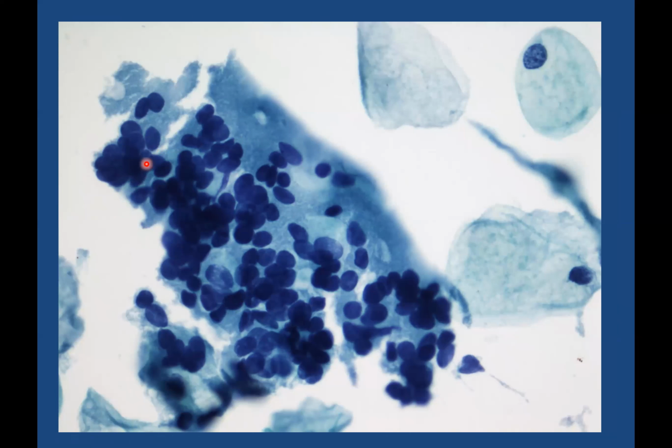They look almost like bunches of grapes within multinucleate cells. The nuclei are very uniform and featureless with one another. Sometimes the cytoplasm can be lost and they just look like hyperchromatic groups, but they're very uniform, difficult to tell apart in that instance from endometrial cells. I don't think it matters too much. The important thing is to recognize that the chromatin is featureless and this is not high-grade CGIN.